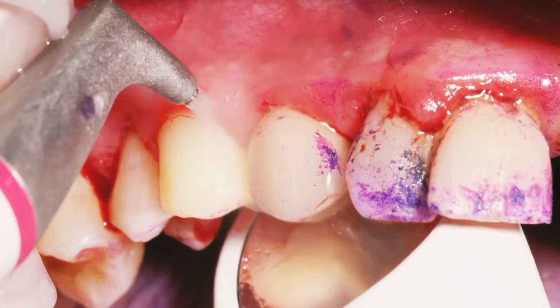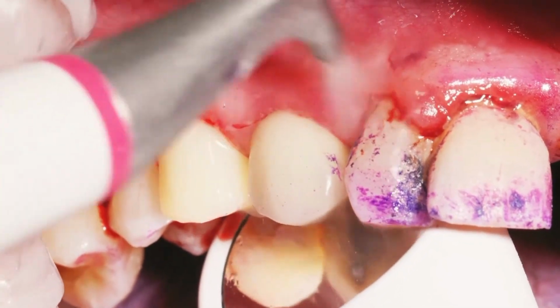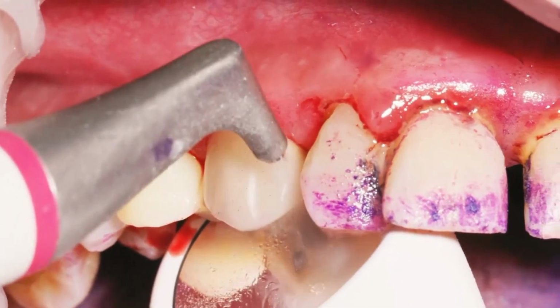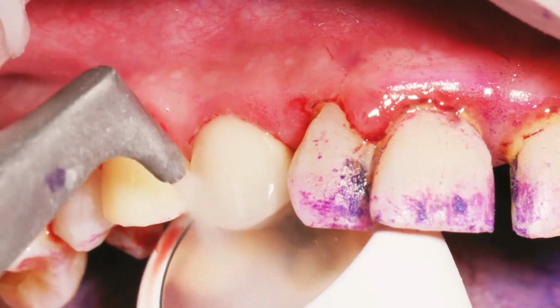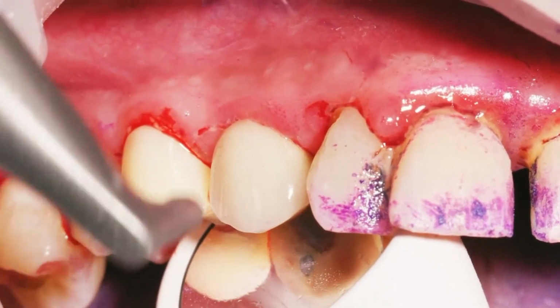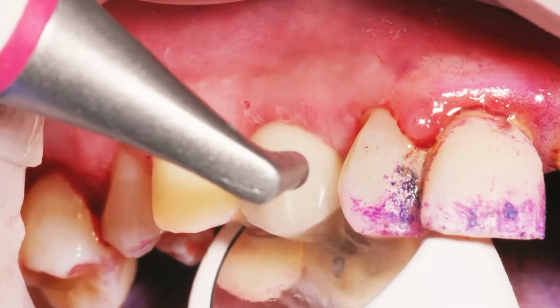But during this step, you start to reduce the infection and the bacterial load in the mouth, and you will be able to see very well where the calculus is positioned and how you need to remove it.